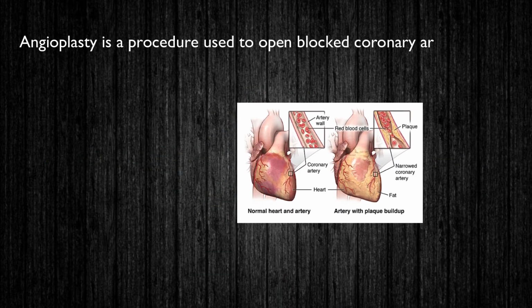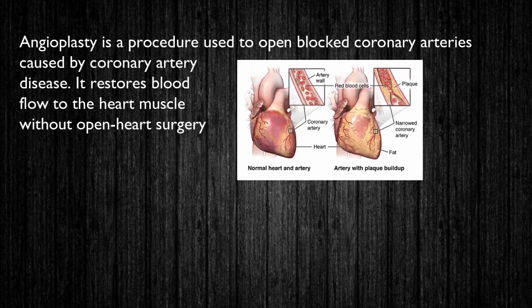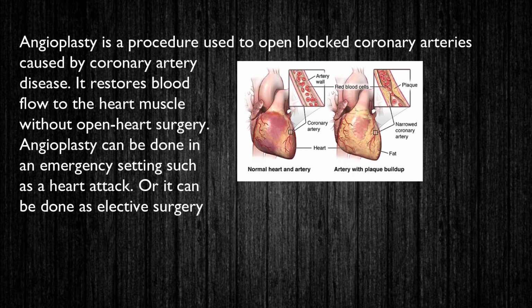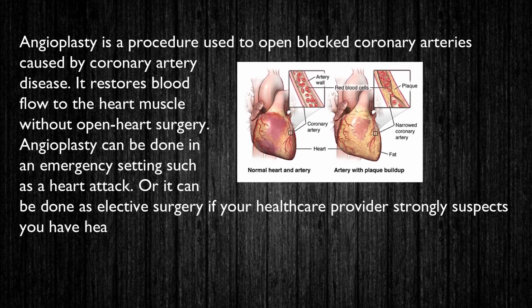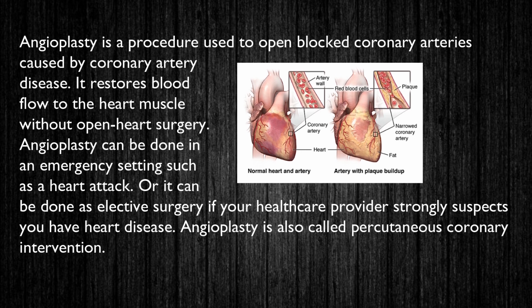Angioplasty is a procedure used to open blocked coronary arteries caused by coronary artery disease. It restores blood flow to the heart muscle without open heart surgery. Angioplasty can be done in an emergency setting such as a heart attack, or it can be done as elective surgery if your healthcare provider strongly suspects you have heart disease. Angioplasty is also called percutaneous coronary intervention.